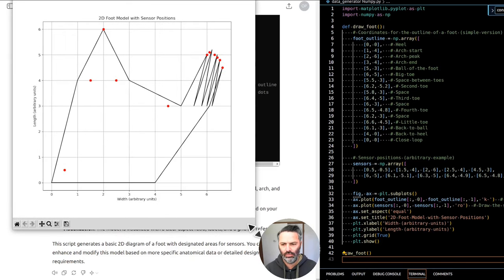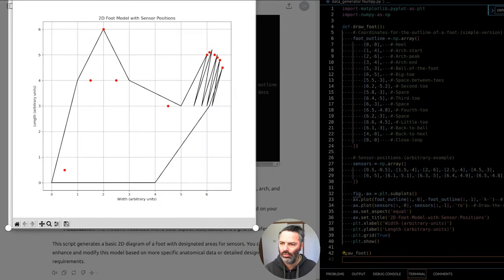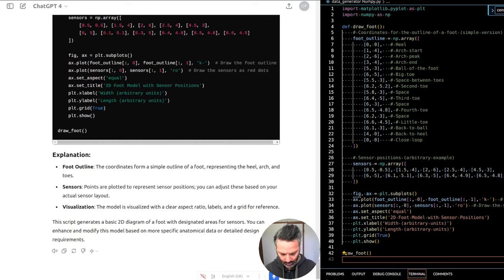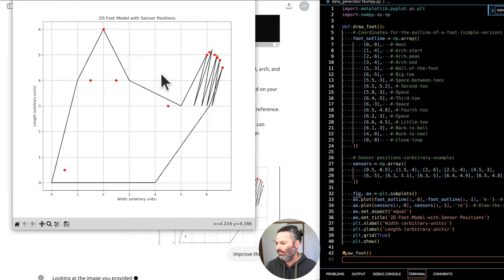4. Implement changes in a test model. Make adjustments to your digital or physical model based on these analyses. Update digital models: if you're using software for your foot model, adjust the sensor coordinates accordingly and document the changes. Physical prototyping: if possible, create a basic physical model or mock-up using materials that mimic the foot's pressure response to place sensors according to the new layout and manually test by applying pressure.